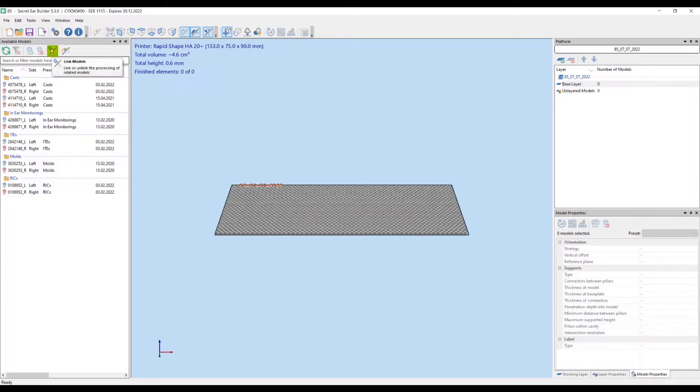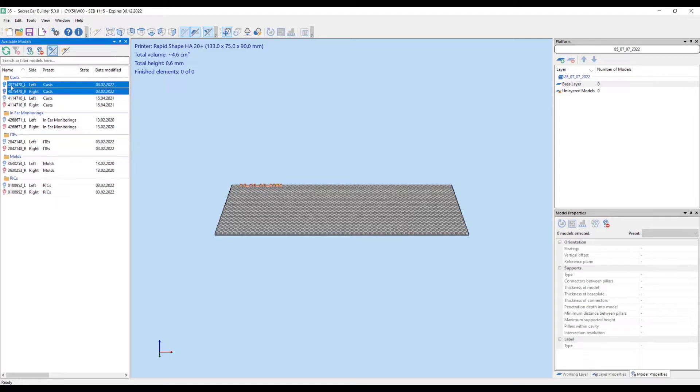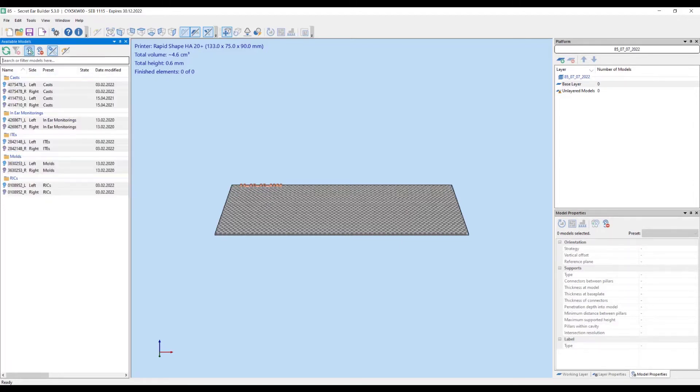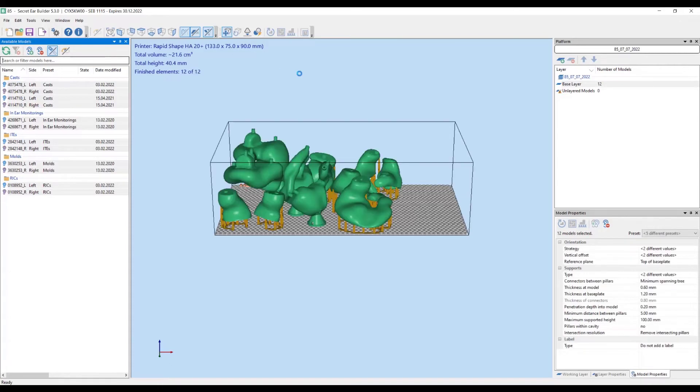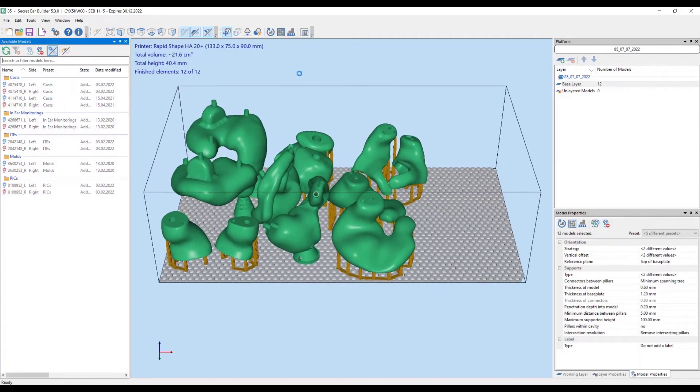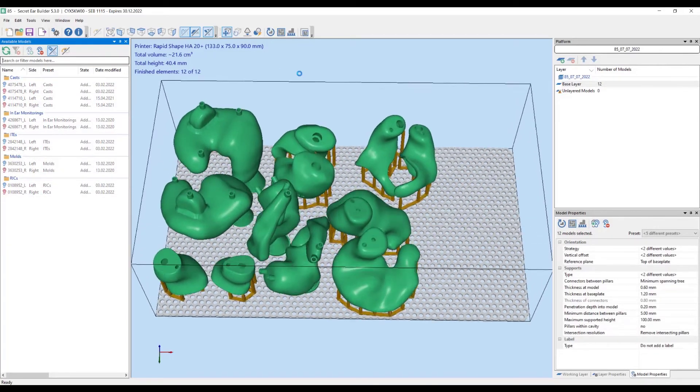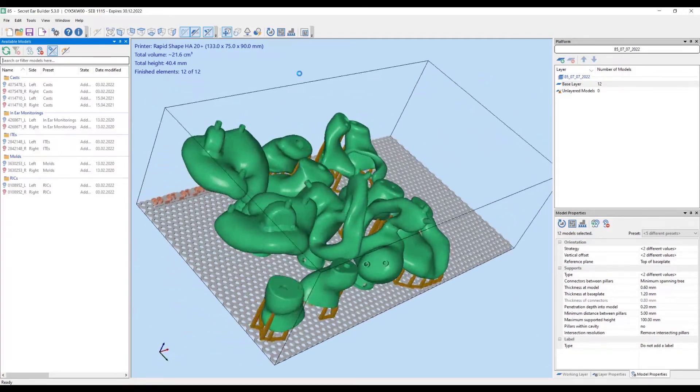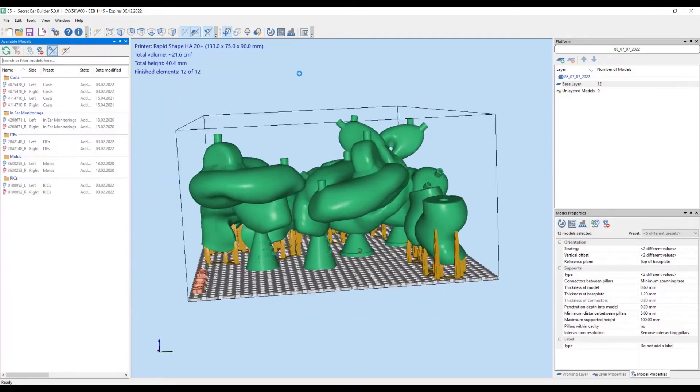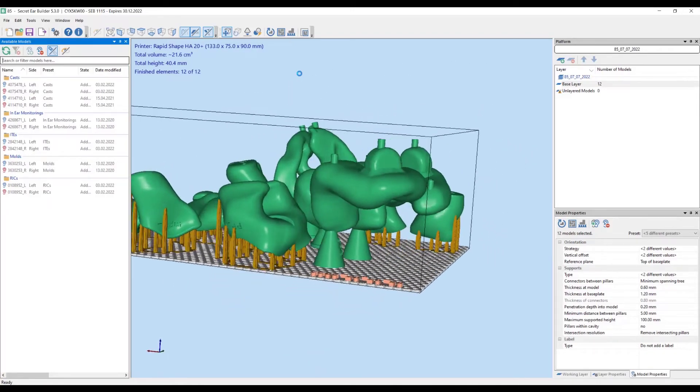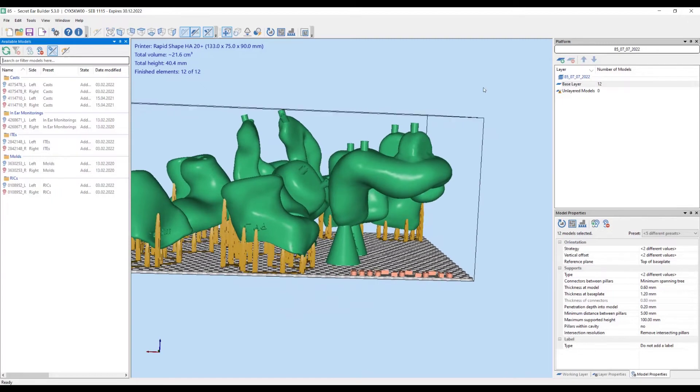We click on the link models button in order to make sure that the left and right ear piece belonging to the same person are processed together. All models are added to the platform. Those with cones are placed flush on the base plate. The others are placed with an offset and structures underpinning them are automatically created.